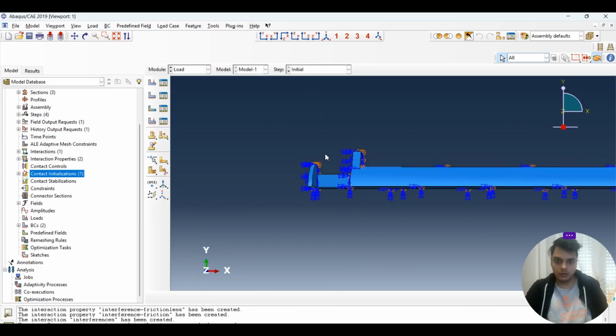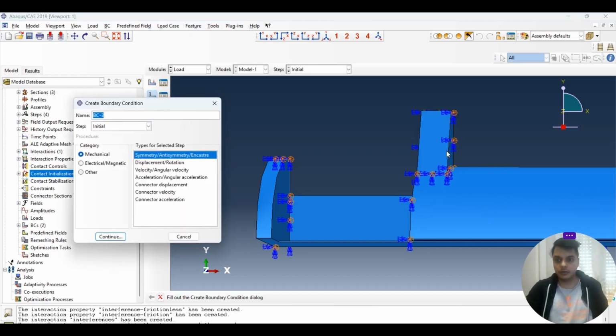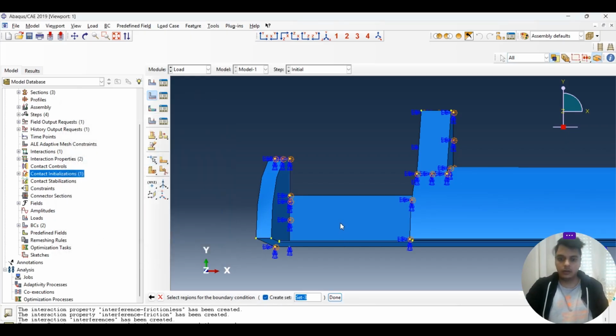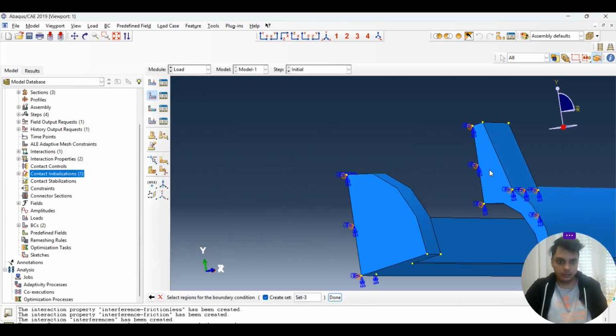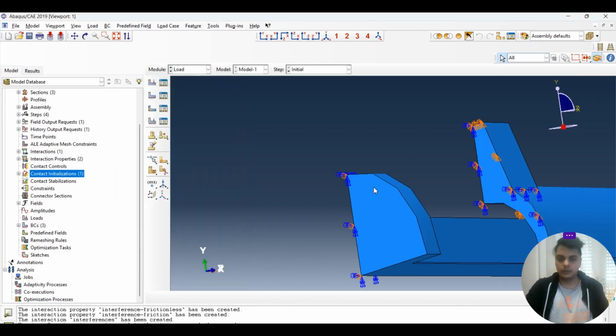Just this part should be okay. This part should be fixed. So it's a fixture. We again go here. We say the fixed part, initial step. We say displacement, and we want this part to be fixed. So it's a fix. So done. We want it fixed in all the directions since it's a solid element, so we don't want rotation either. So this is what we did.